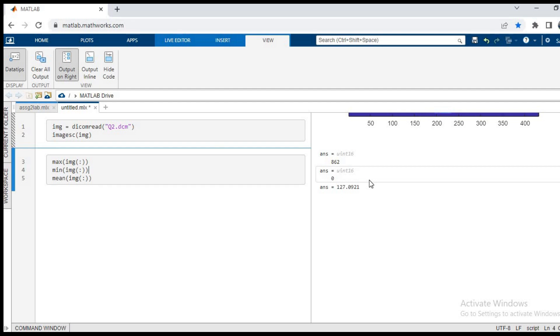Basically we can see that the maximum value is 862 and this is what we target in a normalization. We want to bring the value from 0 and 862 to 0 to 1.